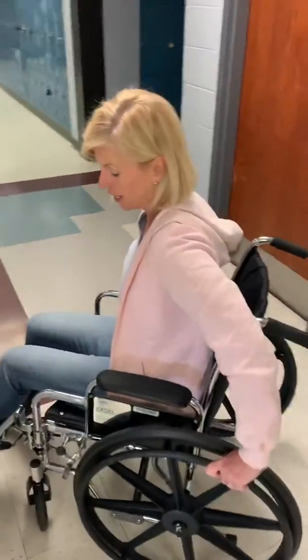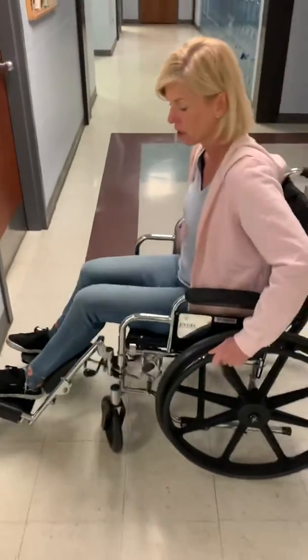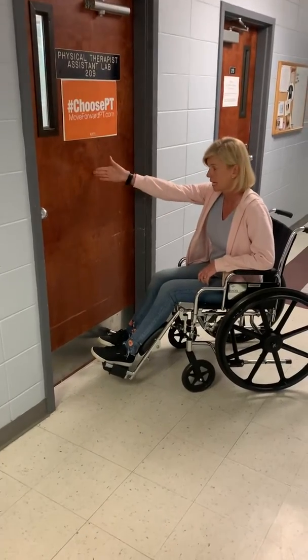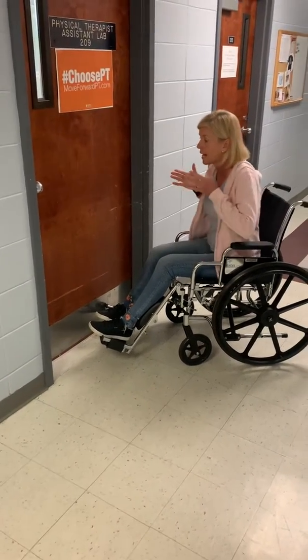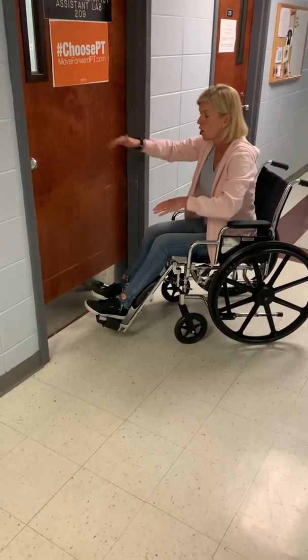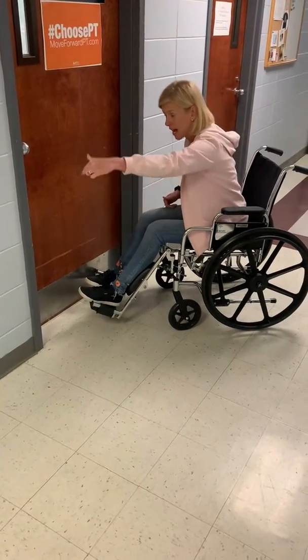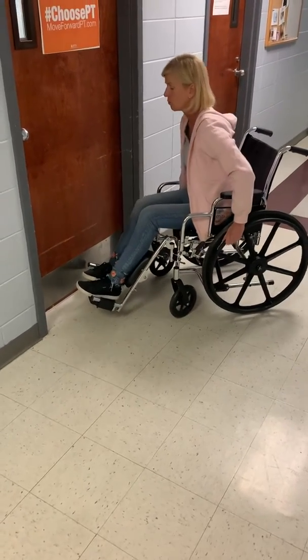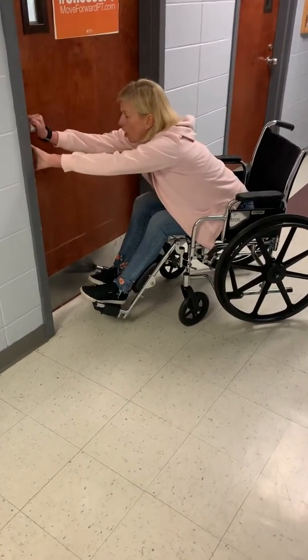Now we're going to go back in that door. Once again, you're going to set up at about a 45-degree angle, because the door is going to open inward. If you're set up on this side, you're going to have to try to get around that door frame. So once again, you're going to open the door and you're going to pull yourself through.